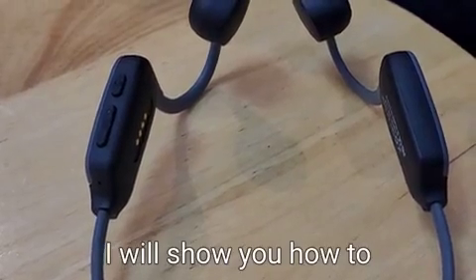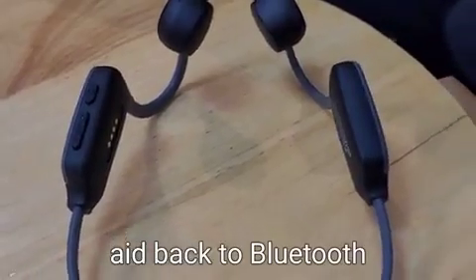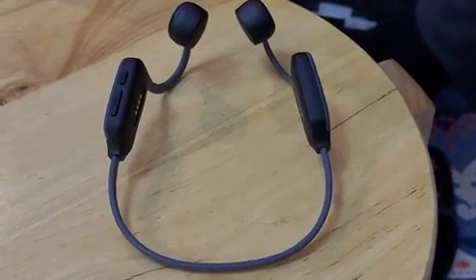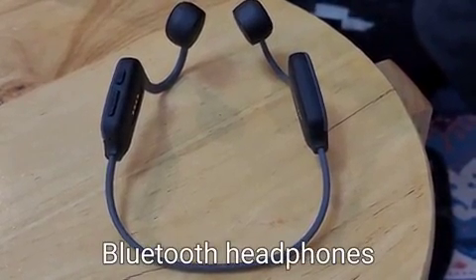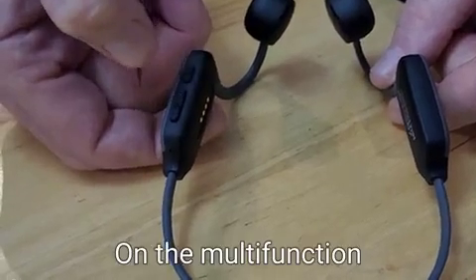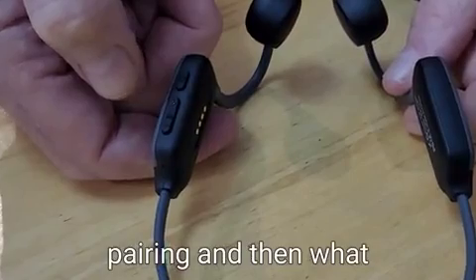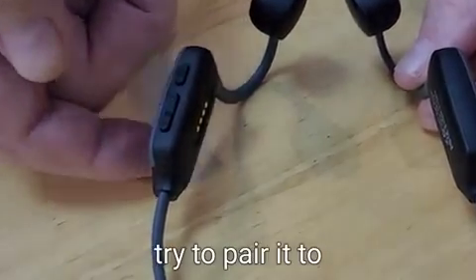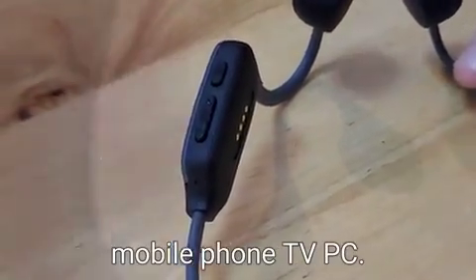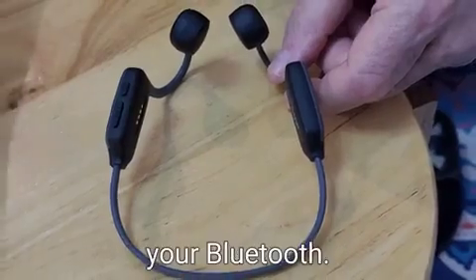I will show you how to switch it from hearing aid back to Bluetooth mode in case you want to use it as conventional bone conduction Bluetooth headphones. What you do is click twice on the multi-function button. You will hear pairing, and then you pair it to whatever device you want — your mobile phone, TV, PC, tablet, whatever you want to listen to on your Bluetooth.